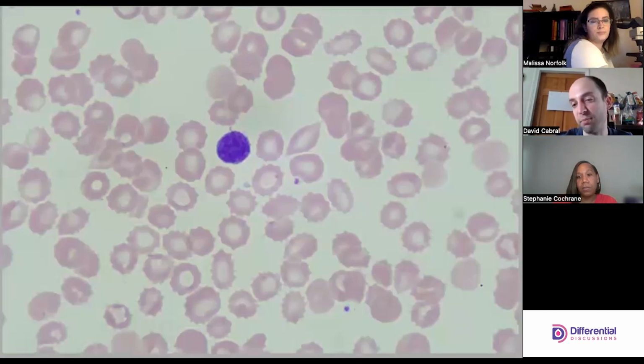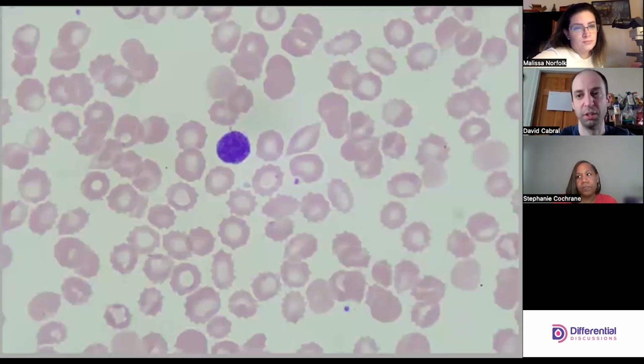You know what would be incredibly helpful? If I had an IPF or a retic, I would feel more comfortable that we don't have to look in the bone marrow. It's probably reactive, right? If I had a high immature platelet fraction or a high retic, to suggest that the marrow microenvironment is doing okay, I could just go to infection and dust my hands off and be done. But well, your retic is 0.7. No kidding. Okay, so normal. That doesn't help me.